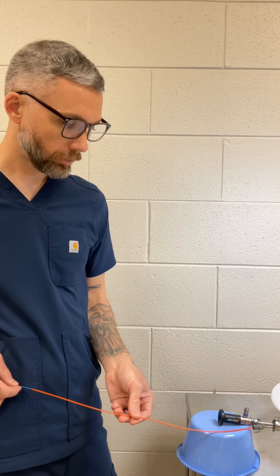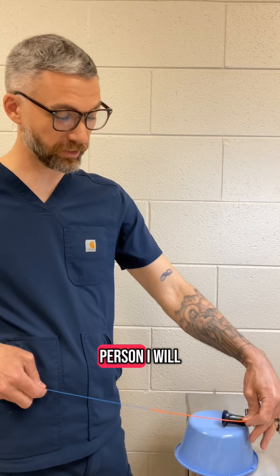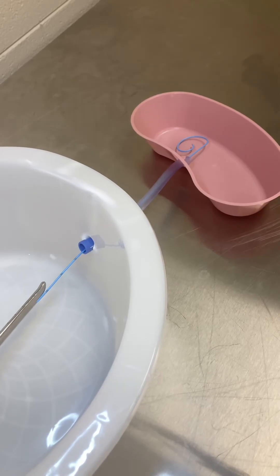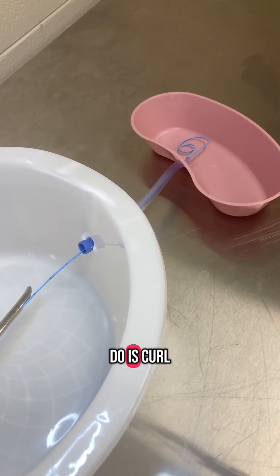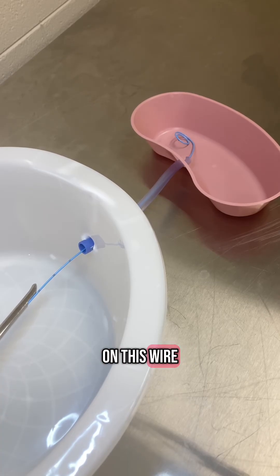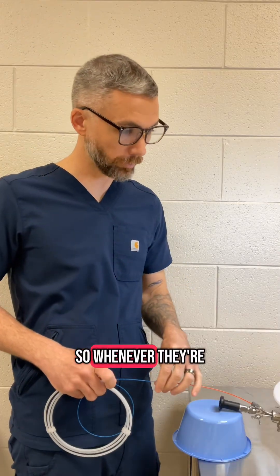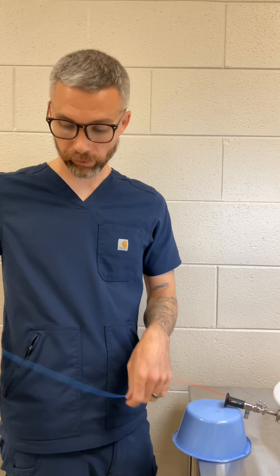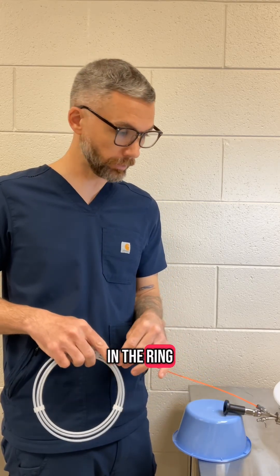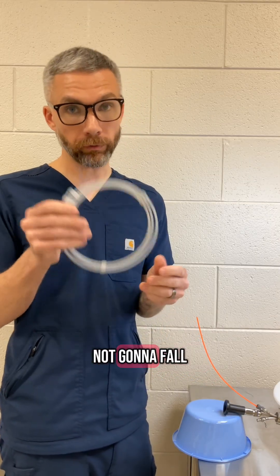That allows them to feed this orange pusher, which will push it up through the scope. It's hard to do with one person. What you want to see is the stent curl in the kidney like that. Then they're going to pull back on the wire, which should leave the curled part in there. They may pull it back a little bit, so whenever they're pulling that stent back, you're feeding this back in — so it's already controlled and you can feed it right back in the ring. That way when it comes out it's already controlled and it's not going to fall on the floor.